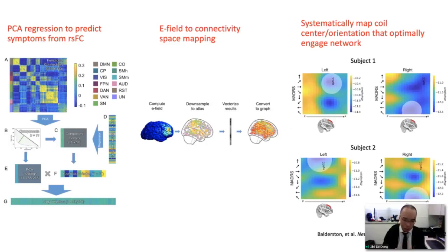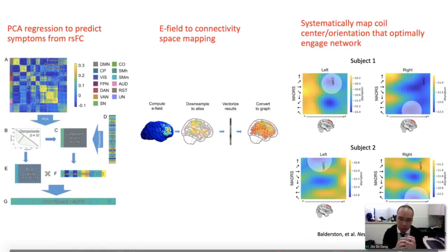In the anxious misery patients, the model predicted a significant decrease in the depression score for sites near Brodmann area 9, but not over the motor cortex. In the control subjects that we looked at using this method, there was no site and orientation combination that showed a significant predicted change in depressive symptoms. Next slide.